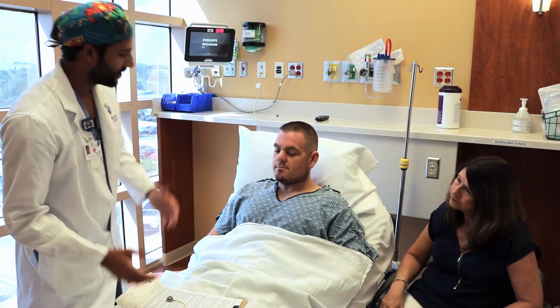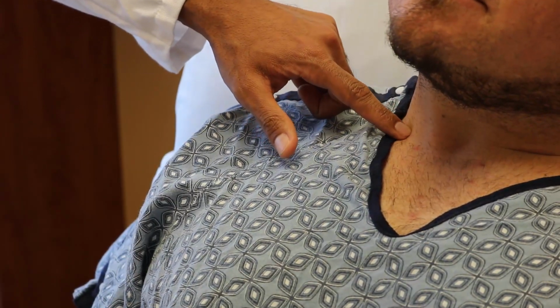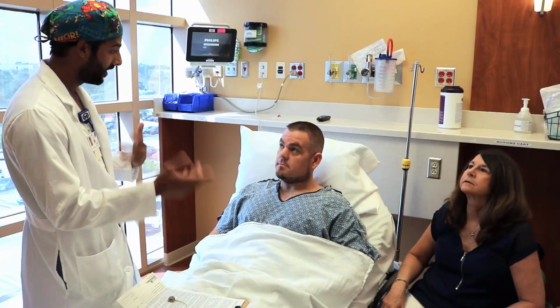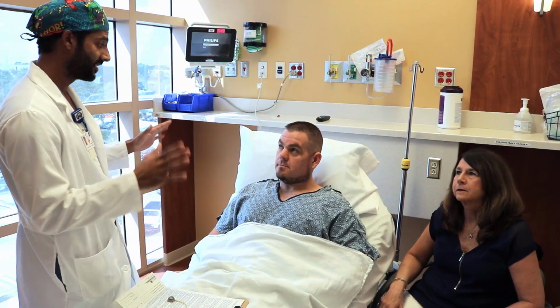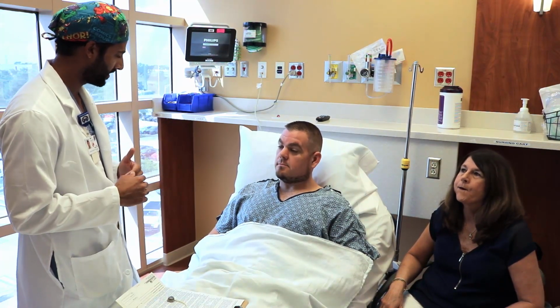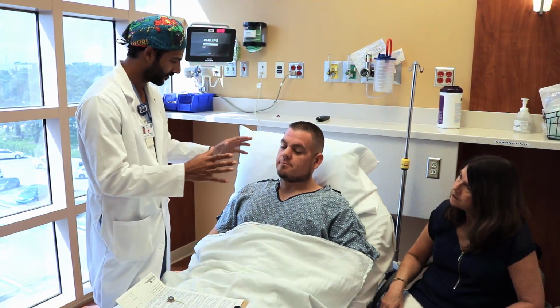What we do is we get you on the table, we give you some numbing medication here and here. Now, of course, we do this after giving you some moderate sedation through the IV that we're going to start. That makes you sleepy. You're not totally asleep. You're not totally out of it. You're kind of dreaming. Okay, does that make sense? Yes, sir.